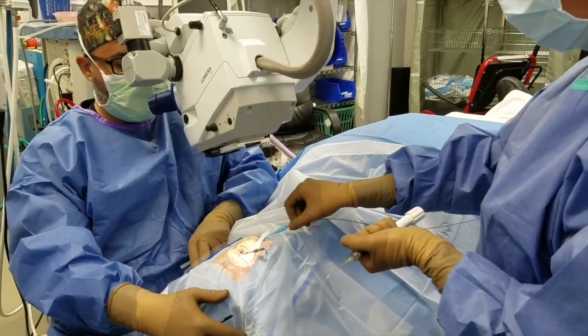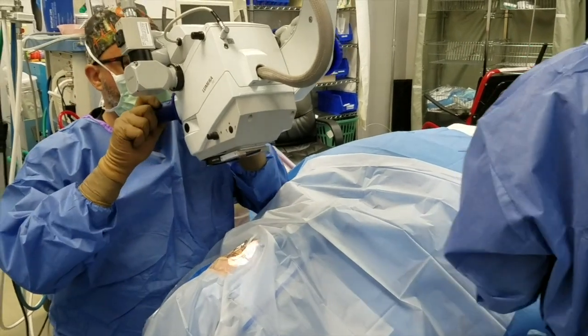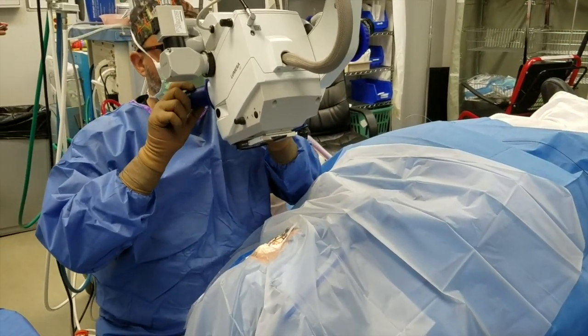The iTrack catheter is retracted completely out, the patient's head is tilted back towards me, and the OVD that was placed into the anterior chamber is removed with the irrigation aspiration handpiece.